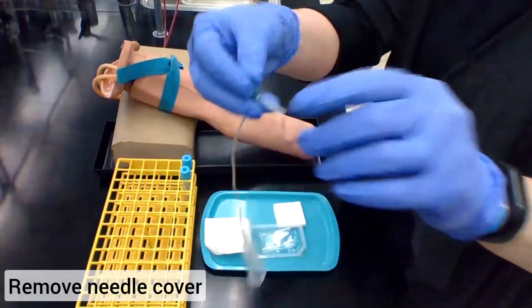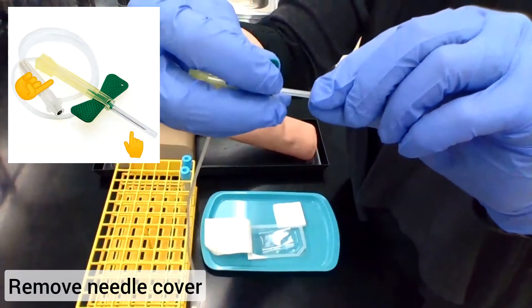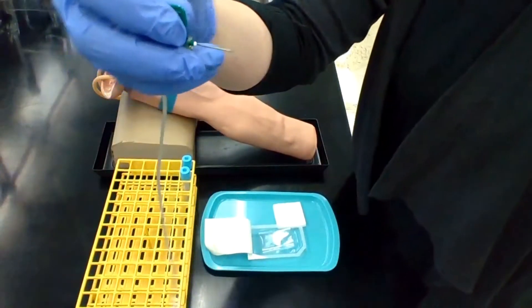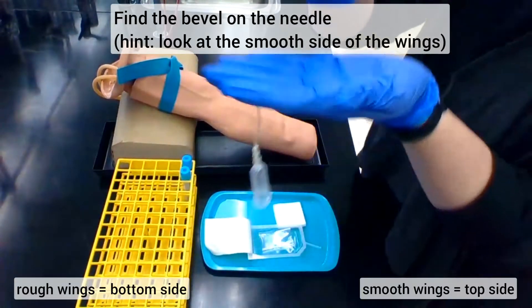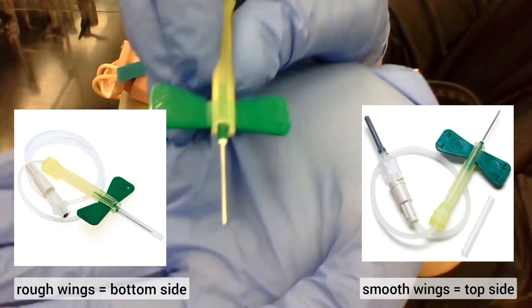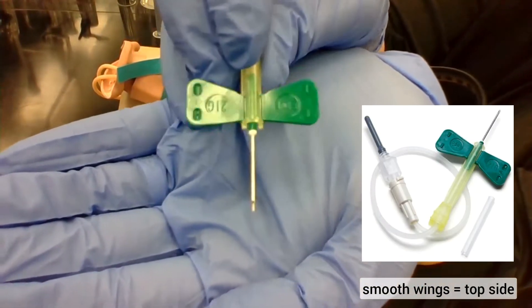Remove the needle cap by grasping the needle at the base by the tubing and then pull on the tube that covers the needle. Now that your needle is uncovered, take a look at that bevel. The bevel will be on the side with the smooth surface on the wings.